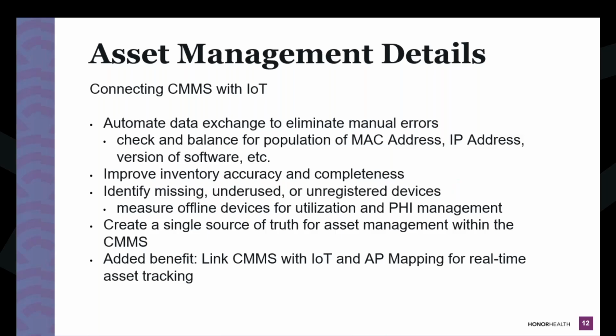Yeah. And for those of you that joined Ben's presentation earlier on asset management too, he emphasized the importance of knowing what devices are offline, are not there, or can't be located that have PHI on them, right? So for us as an organization, when we started measuring this and we started looking at the devices, this was years ago, there were 600 of them where we were like, okay, but it's not that they were missing, it was that the asset management portion wasn't there, right?